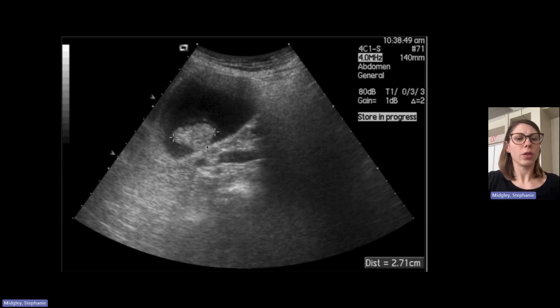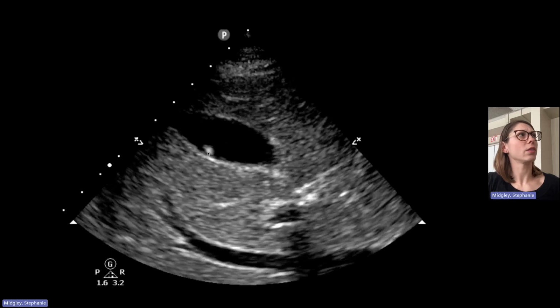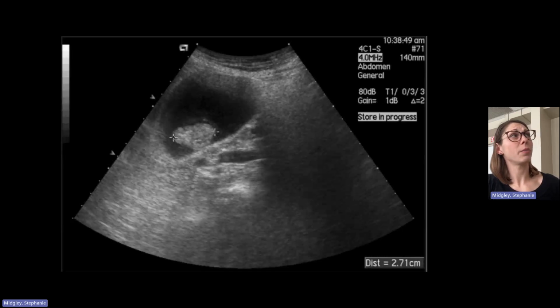So you can look at this as what we call a pedunculated polyp, where it looks like it's on a little stalk. This is a sessile polyp, which is a little bit flatter. So depending on the size, usually a polyp more than 1 centimeter is going to have a higher risk of malignancy, and those require close follow-up. If you find a polyp, you should get some sort of follow-up scanning in the future, could be 6 months to a year.